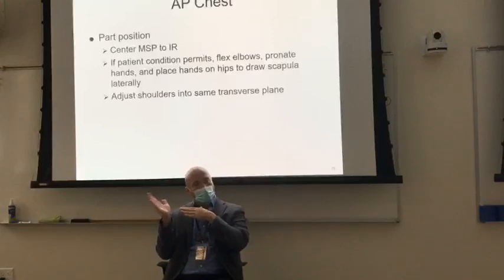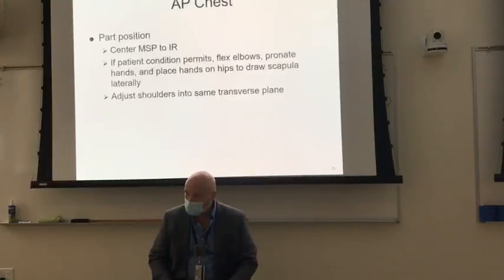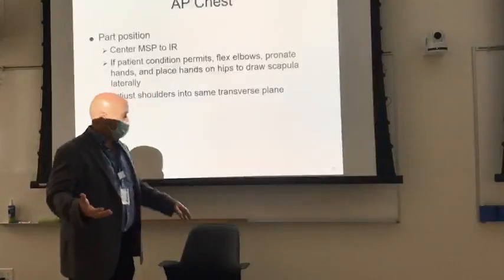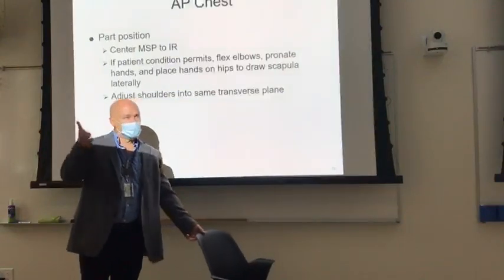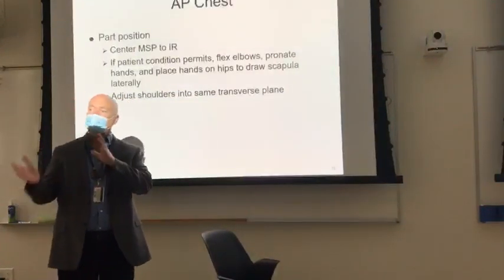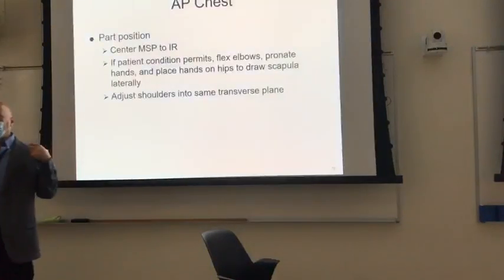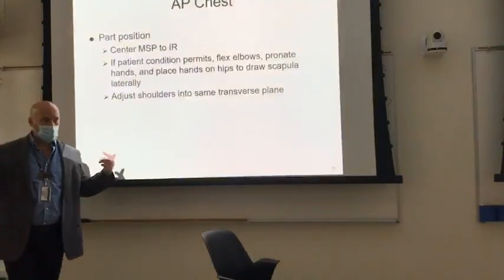Because they're stiff, you start pulling the patient forward, and the hammies just can't tolerate it anymore. Right? So what you might want to do is get the patient part way up, put the image receptor behind them, and then sit them the rest of the way up. Okay. Top of the image receptor, 1.5 inches above the outer portion of the shoulders.